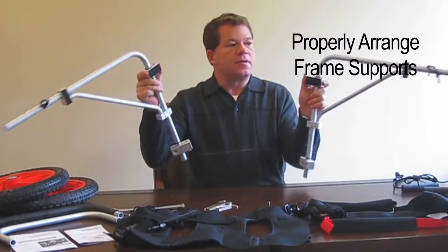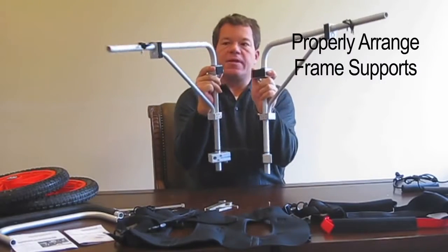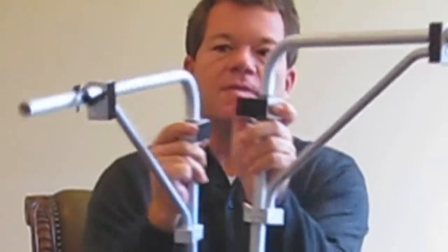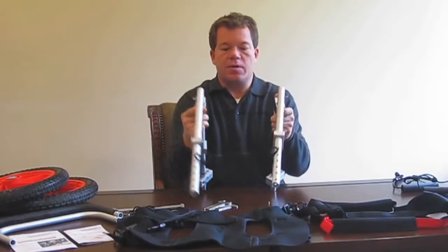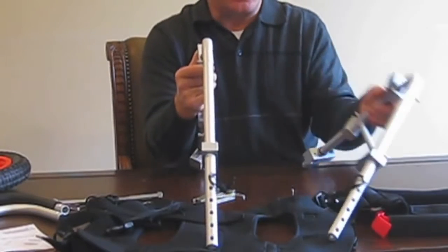You have the two frame supports — the right and the left. You can tell if they're mixed up and not in the correct order because the bike pads should be facing each other. Each one should be facing each other — this is the correct order. The first thing we install is the upper rear crossbar.